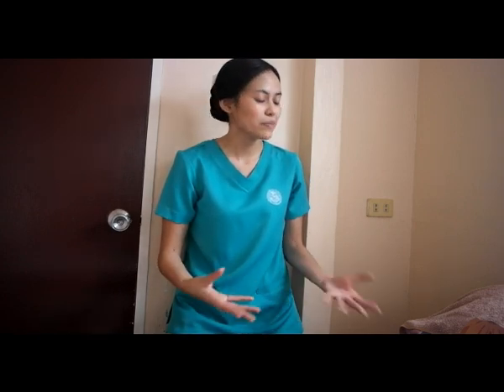Then, we tell our patient honestly that during this procedure it might be painful, but it is tolerable. Next is to provide privacy by drawing the curtains and closing the doors, and by draping them properly, exposing only the female genitalia. And to formally start with the procedure, we perform hand hygiene.